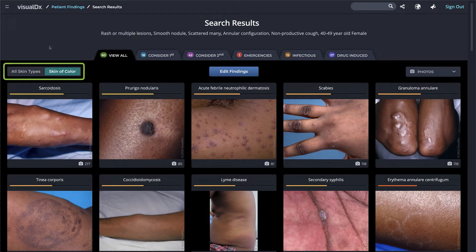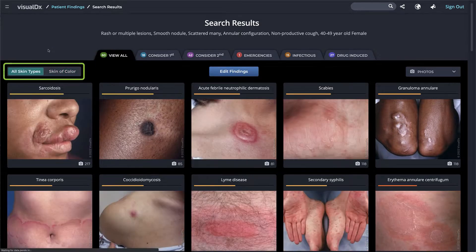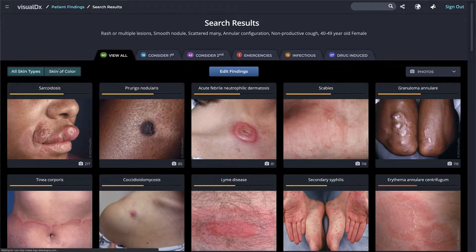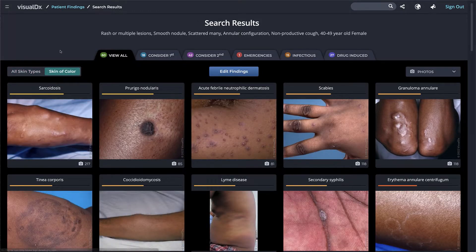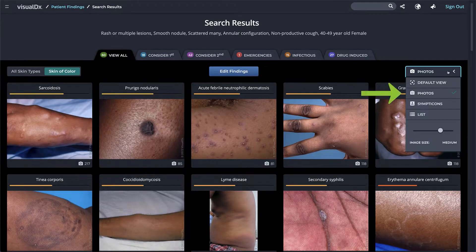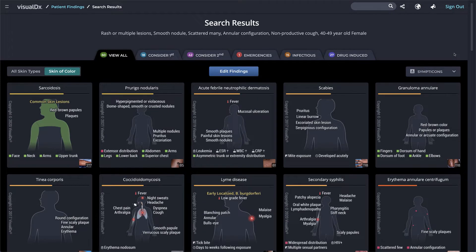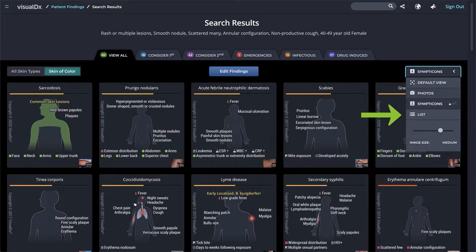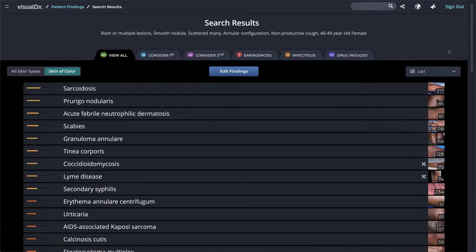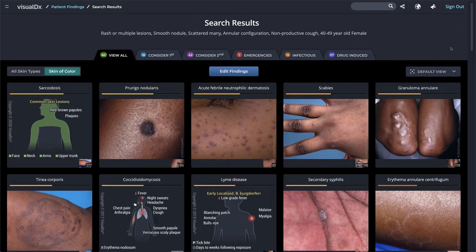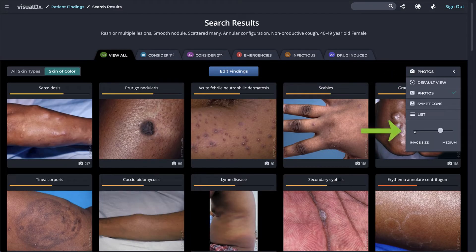Since our patient is a person of color, we have the skin of color toggle turned on. However, we can easily switch to all skin types to see a variety in our differential view. Within the tabs, you can view the diagnoses in a number of ways. Since your patient has a rash, VisualDX displays photos for easy comparison. You can switch to the Symptom-Con view, which displays hallmark symptoms visually, the list view to quickly scan your results, or the default view which is a mixture of image types.